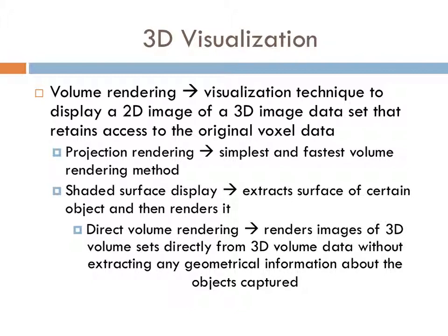So going back real quick to shaded surface display, I just want you to know that this can be fast, but it really doesn't provide any view inside the object that we're looking at and requires segmentation that is kind of labor intensive sometimes.